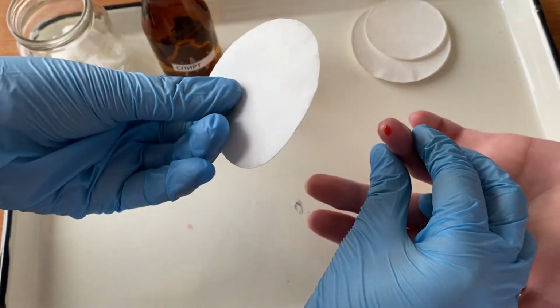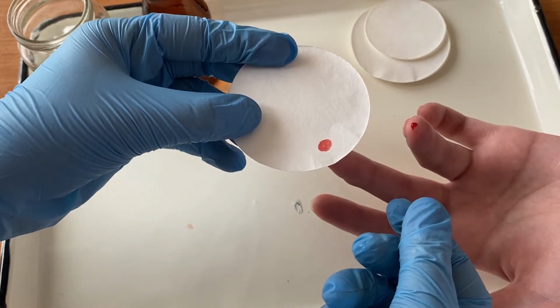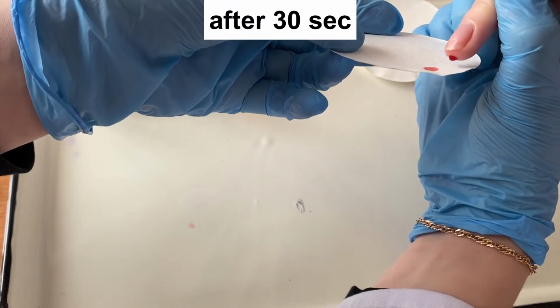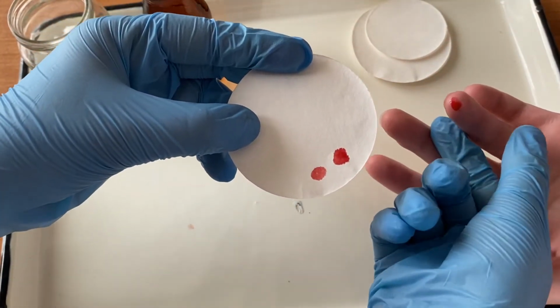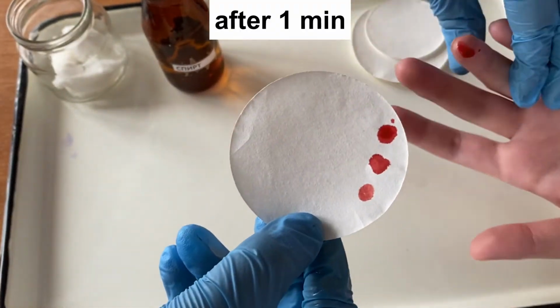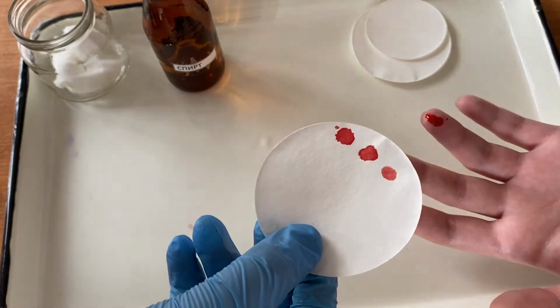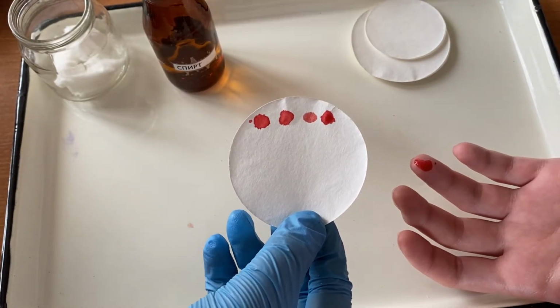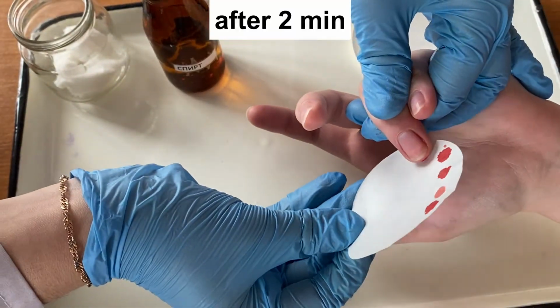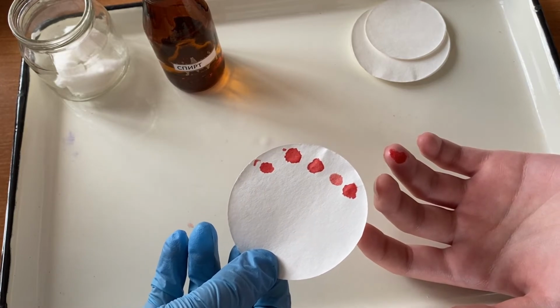We blot the first drop of blood with filter paper. They mark the time with a stopwatch. Protruding drops of blood are blotted every 30 seconds with filter paper without touching the wound. Each time a drop of blood becomes smaller on the filter paper, this means the bleeding gradually stops.